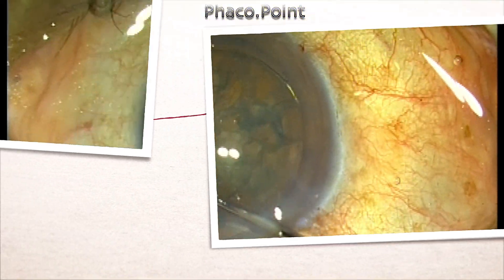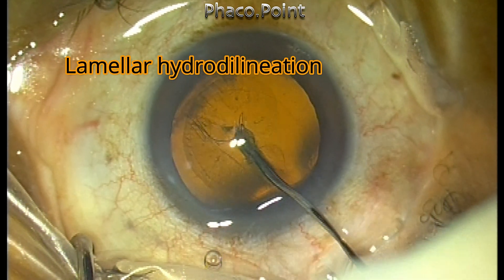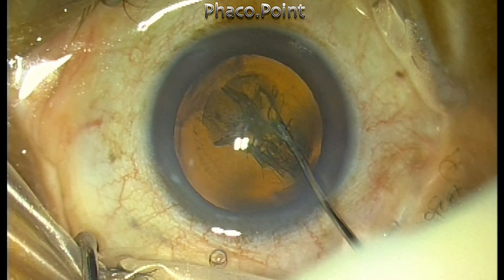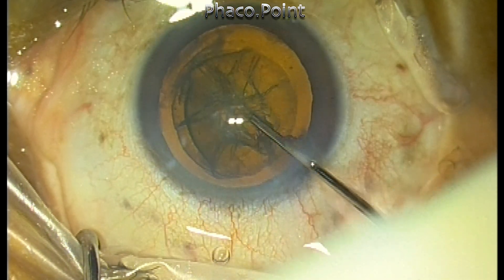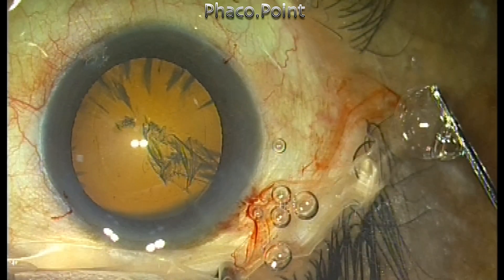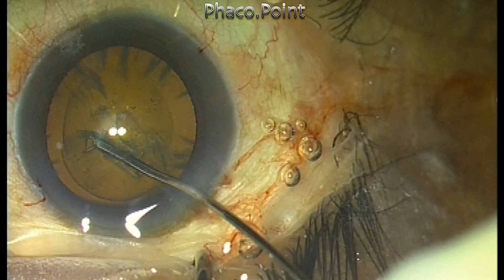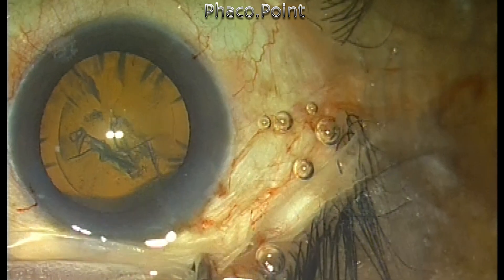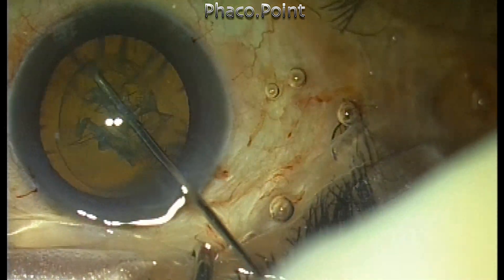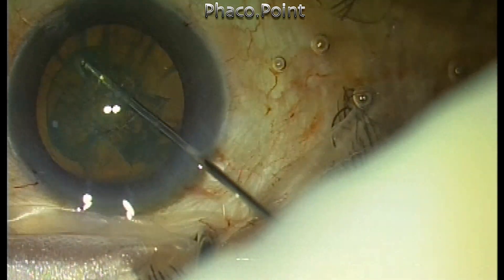However, the lamellar technique is slightly different. We take the cannula into the center of the lens, push it through the epinucleus core, and when you reach the center you inject a small aliquot of fluid. The fluid finds its way through the lamellar plane and delineates the circumferential edge of the lens. Once the circumferential edge is delineated, take the cannula to the edge of the delineated circumference and by strategically injecting small amounts of fluid you are able to complete hydro delineation.